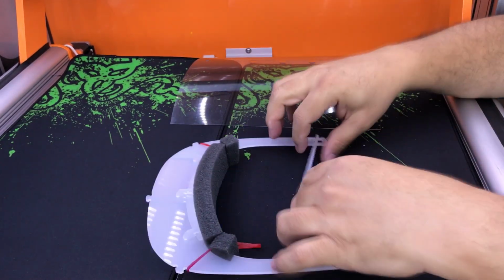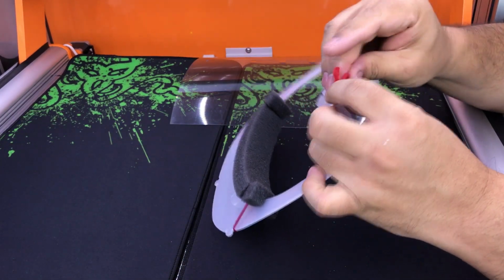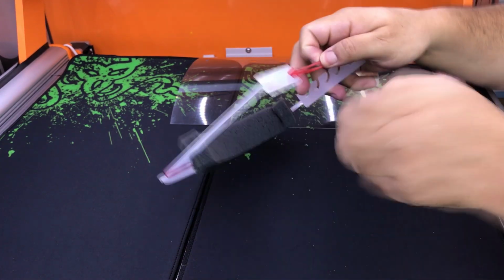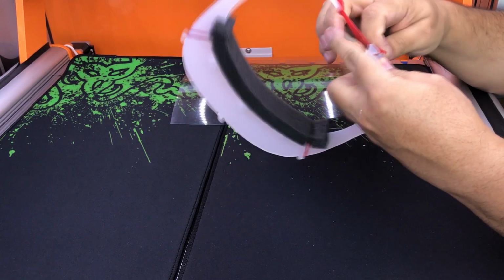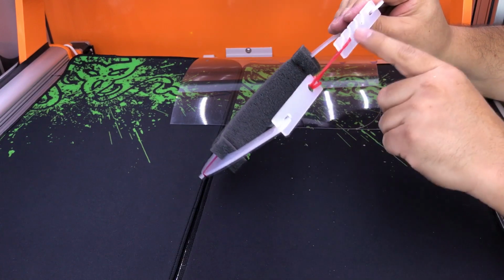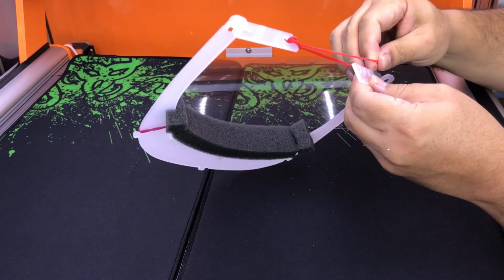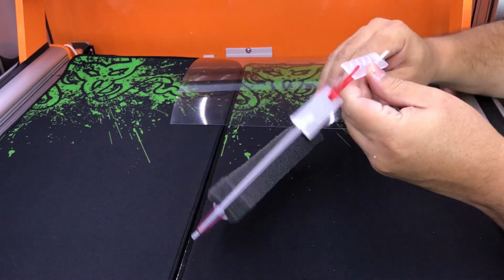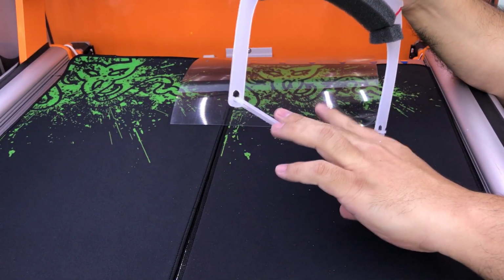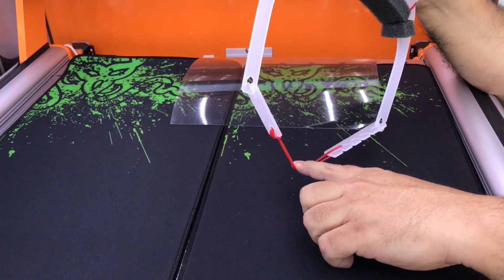Now, how to hold the rubber band, it's very simple. You put the rubber band here on the hole. You pass it through the same rubber band. You take a little, and that's it. That's how you hold it. You can have more tension if you like, but it will depend on the size of your head. And this fits very, very nicely on many sizes of head. And it doesn't hurt or anything.